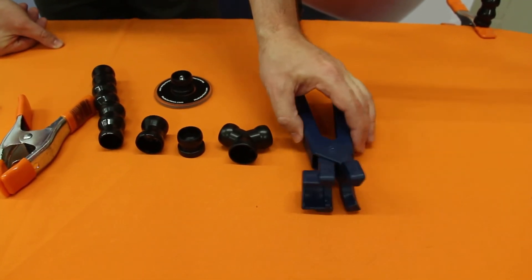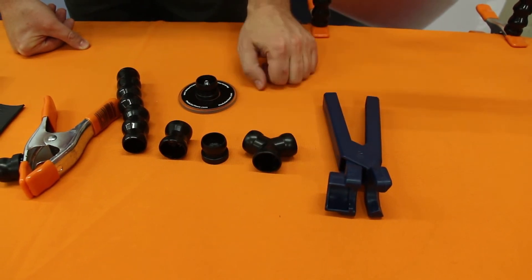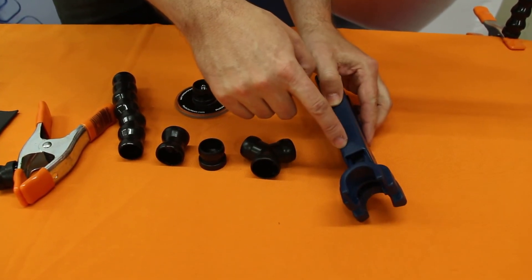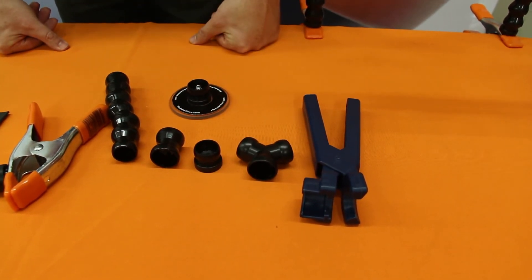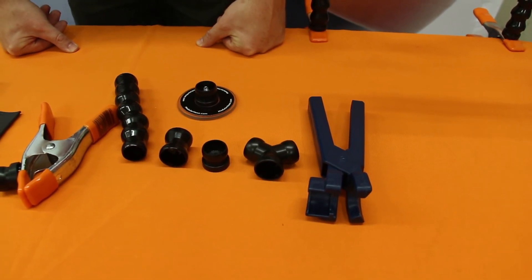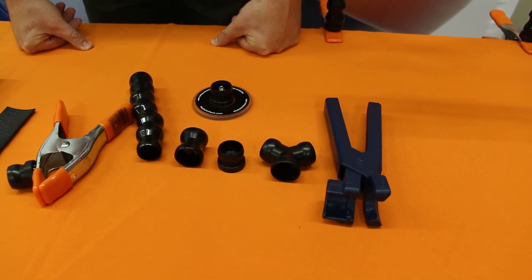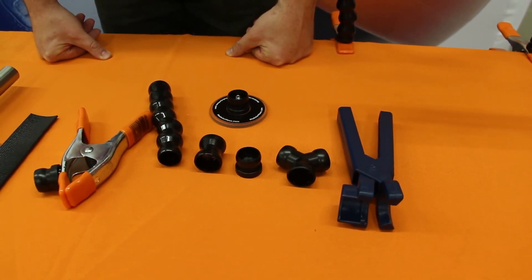Lastly, we have the assembly pliers. These are for the three-quarter inch system. The pliers are labeled 'ball end up' and 'socket end up,' which tells you the pattern of the lock line and how to orient the pliers when putting it together. They are used only for assembling the lock line, not for taking it apart. To disassemble, you simply bend the lock line on itself until it pops.